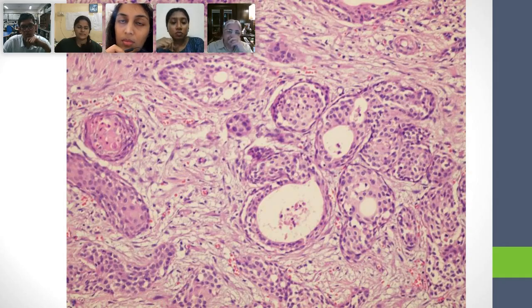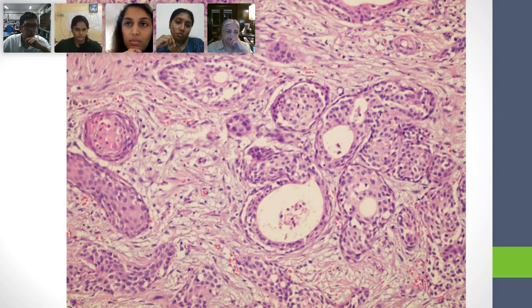Now here, come on, Ashish, tell me. The ducts show a luminal and an abluminal differentiation, with areas having squamoid, squamous-like differentiation, and there is some cribriforming over it. So there is some cribriforming which we can see. Excellent. Multiple little. But what do you want to say about cribriforming?